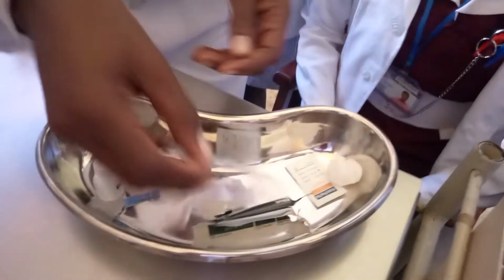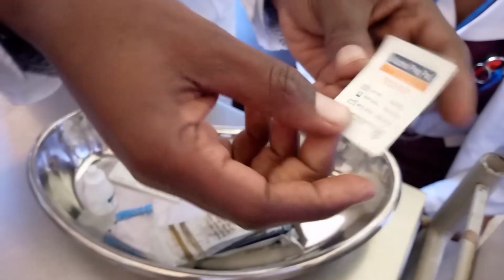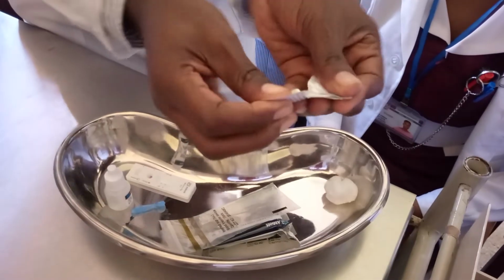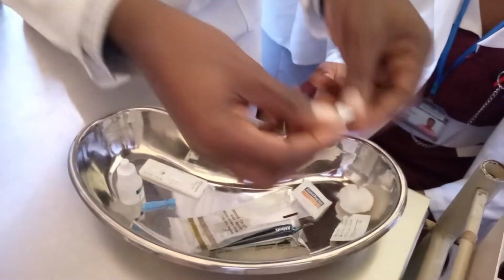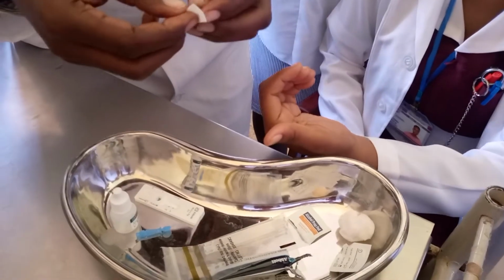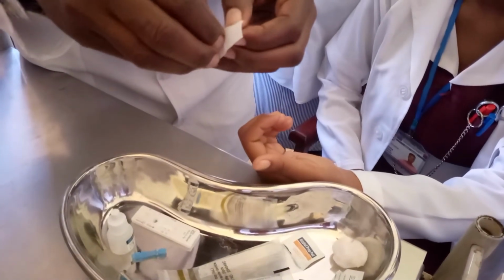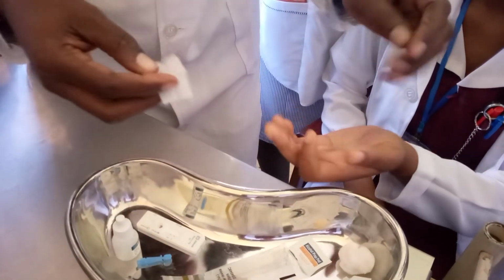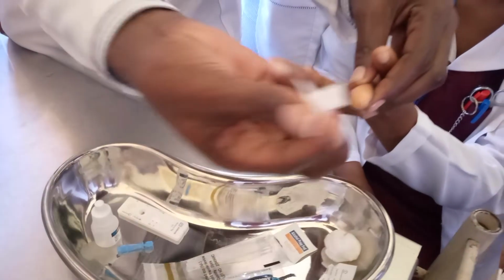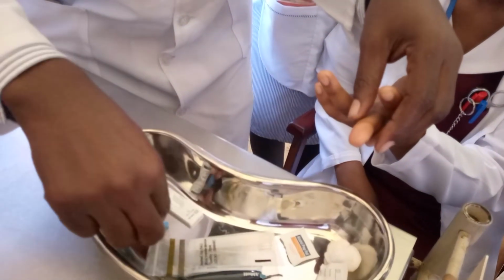So let's see how we start. Here there's an alcohol pad, or prep pad. I'm going to open this. Let me just swipe. Which finger are you comfortable with? Mostly people would want the thumb, but you would also tell the client that the middle finger is preferable because it won't be painful. So you go with the middle finger. You just swipe there. This is the alcohol prep swab. Then after that, you can get the lancet.